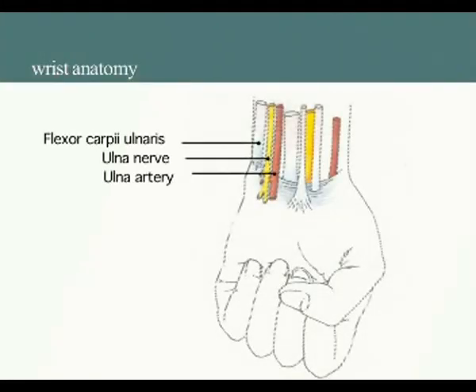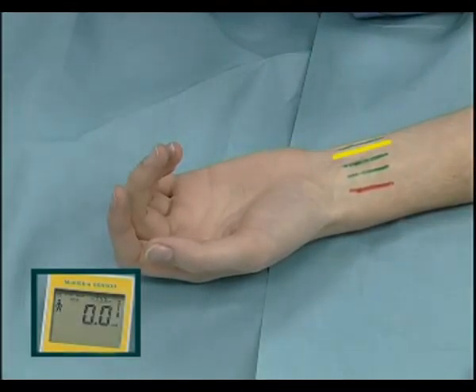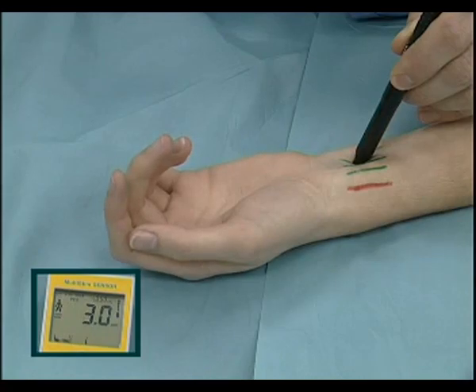Ulnar nerve. At the wrist, it lies between the ulnar artery and flexor carpi ulnaris. Paresthesia is into little finger and ring finger. Motor response elicits twitching of the medial finger flexors.